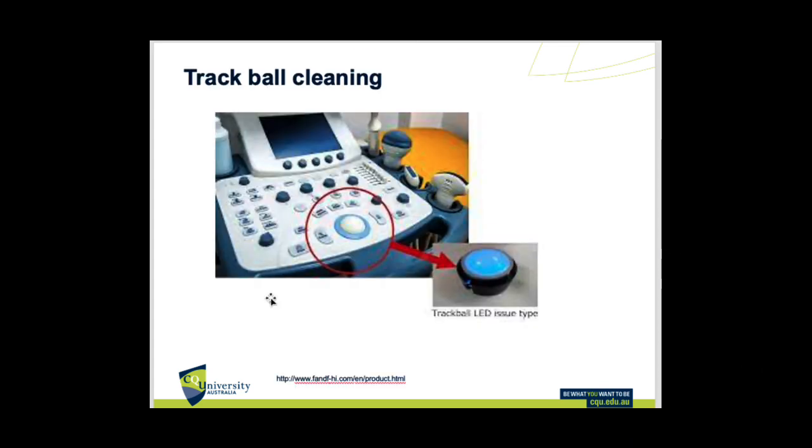With the trackball, remembering this is in front of us and is the thing we use the most with multiple hands going across it, it can get dusty and can actually stop moving or be quite restricted in movement if too much dust and gunk accumulates around it.